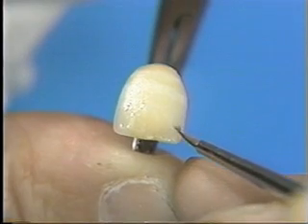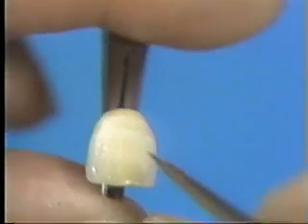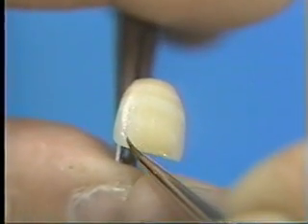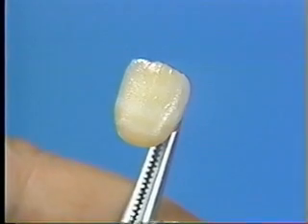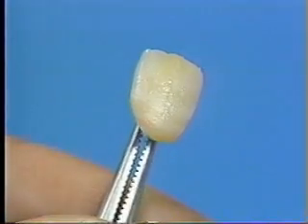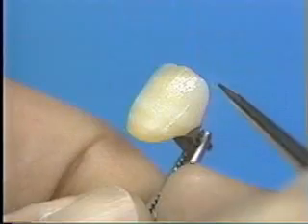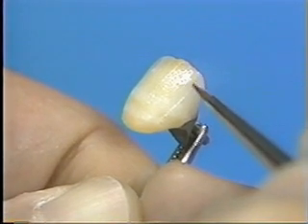Use a small brush for the painting of the fracture line. Any excessive stain of the lines can be removed by a small brush from both edges little by little. On both the mesial and distal sides of the proximal part, if the incisal blue 2 is decorated next to the enamel crack line, the enamel crack line can be presented emphatically.